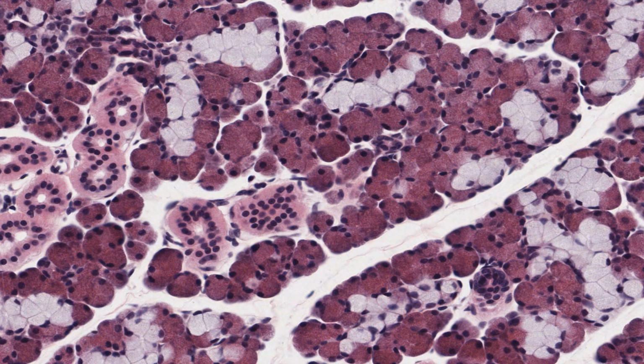Small groups of serous cells frequently cap the ends of mucus acini. You can see some here, and again here. These half-moon-like figures are called serous demilunes. But this morphological appearance is a consequence of a processing artifact using routine tissue fixation methods.